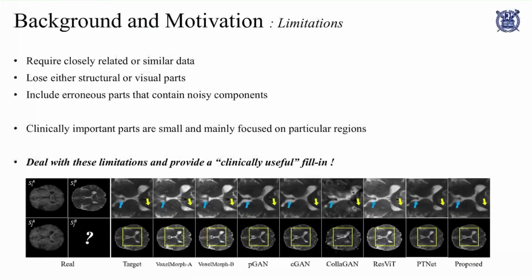To solve these problems, many registration, sequence translation, and imputation methods have been proposed. However, limitations still remain as they require closely related or similar data and lose either structural or visual parts. To deal with these limitations and provide a clinically useful fill-in, we propose this paper.